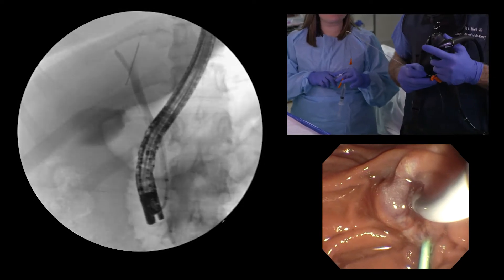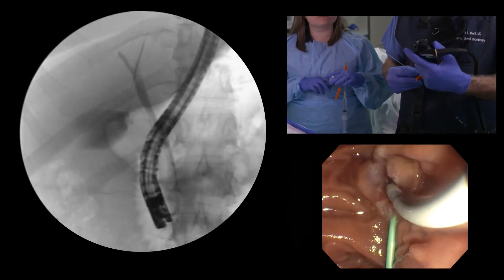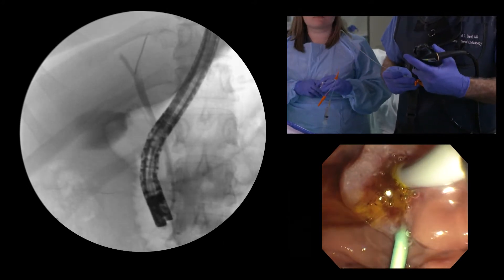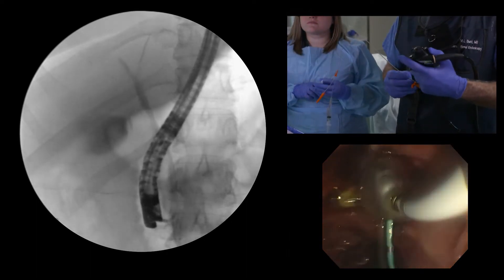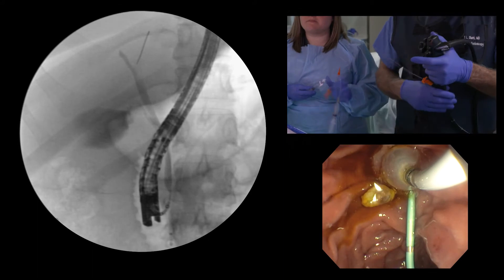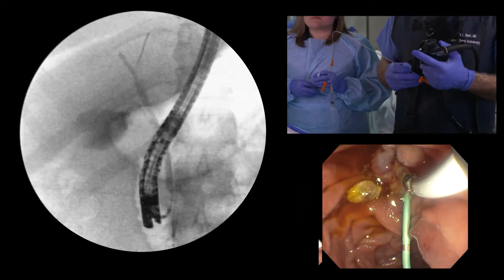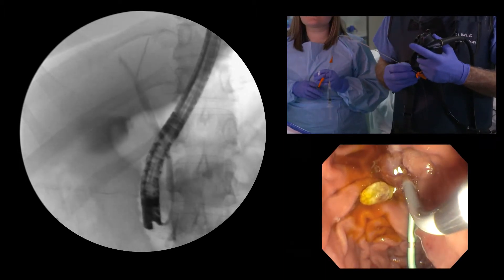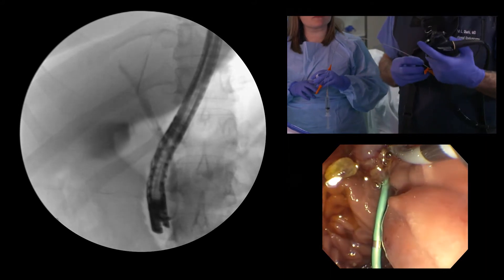Now if you have a duct full of stones, your best bet is to start low like this, inflate here, and sweep bit by bit. There it is — there's a stone. It's better not to try to grab all the stones all at once, because you can compact them and make it very hard to get out.